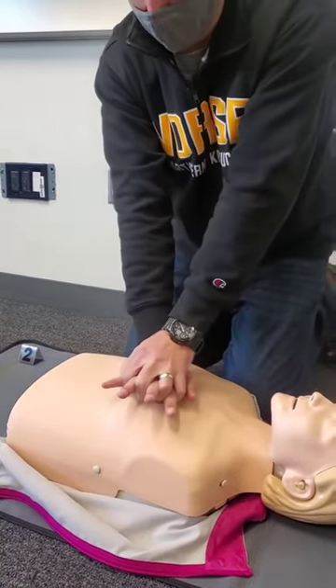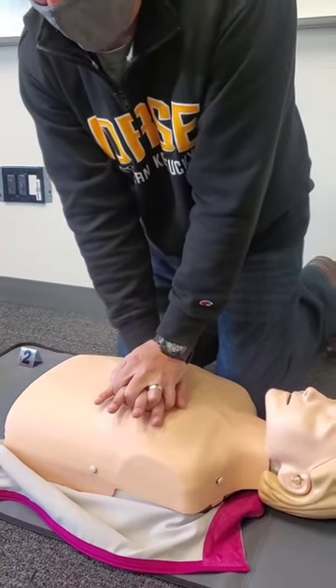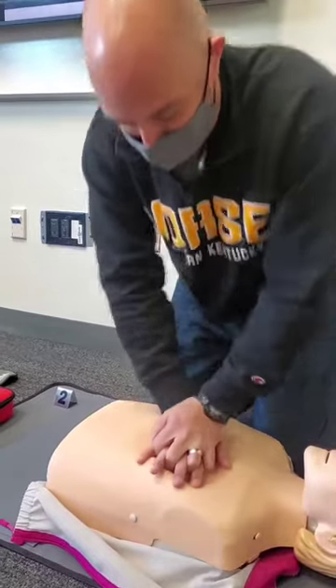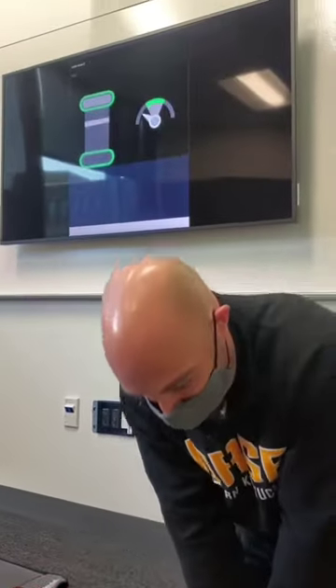It's a flat space on the chest. Look how far I'm leaning over — press hard and fast. My elbows are locked, not folded. I'm using my body weight to compress.